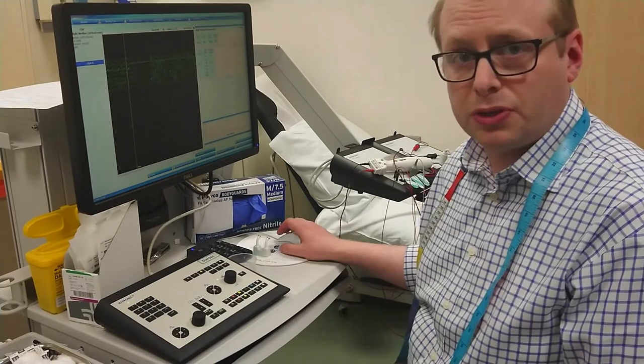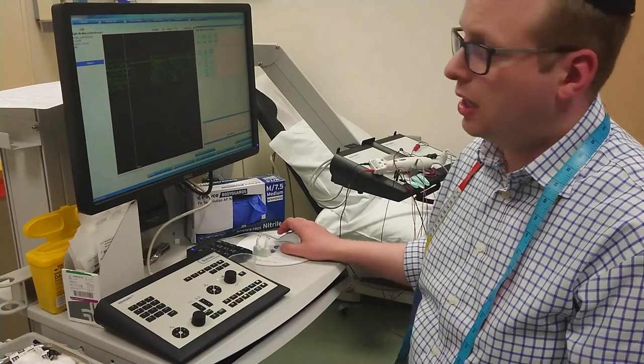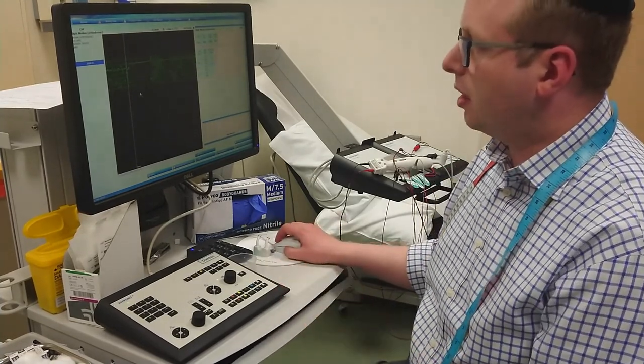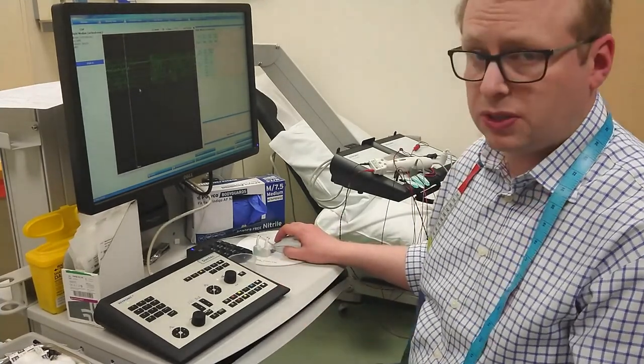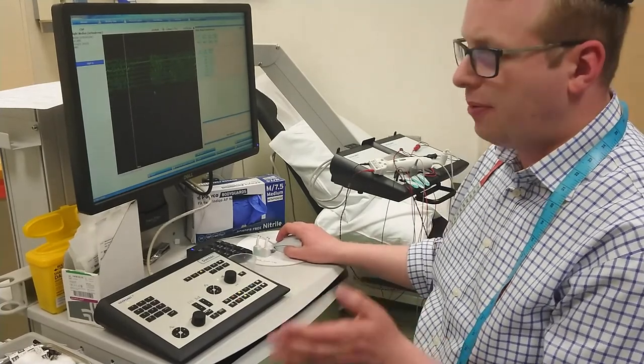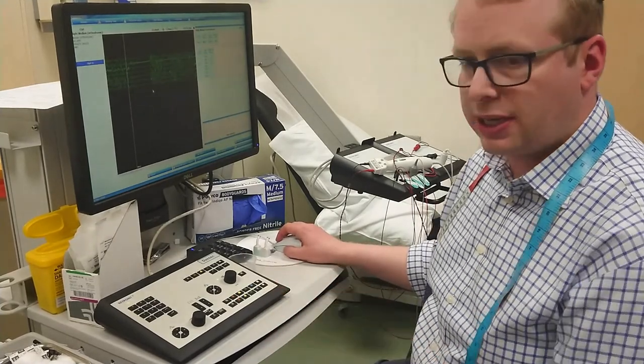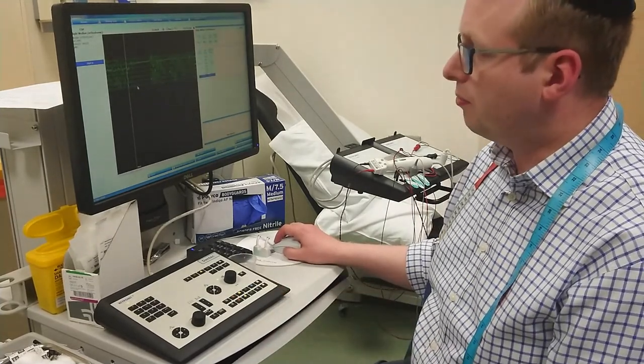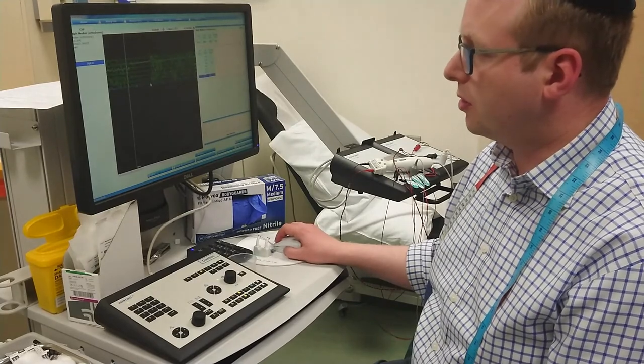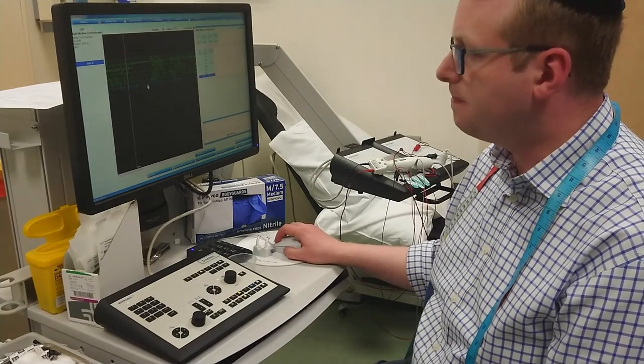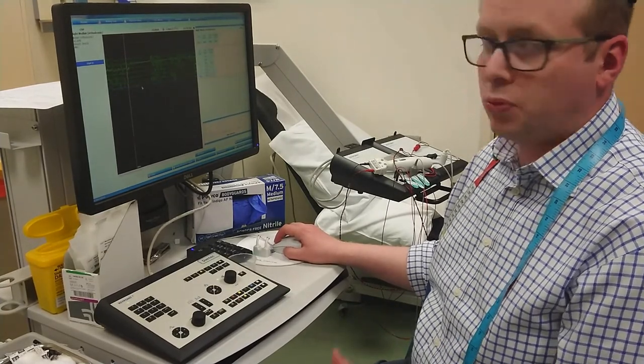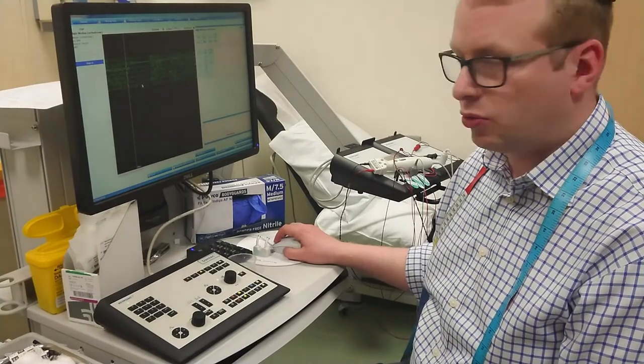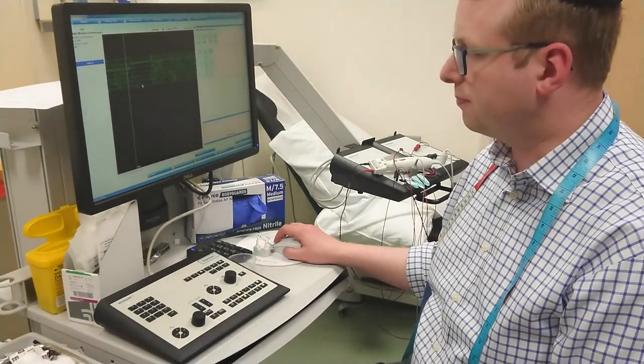Not the most pleasant of tests. What I'm going to do is label up the traces and because I'm using the H reflex program, I've got the M and the H latencies for the terms of the markers to place down on here. We'll have to change that later on in the report itself.